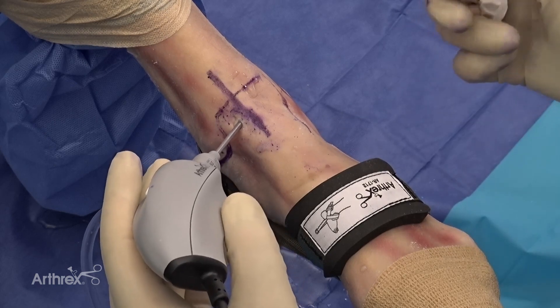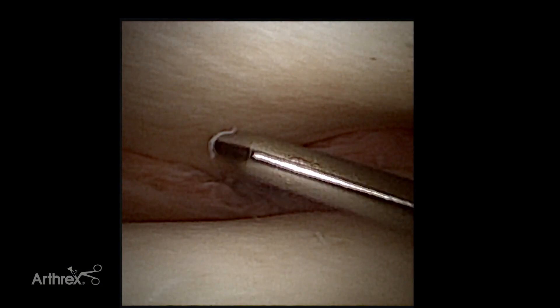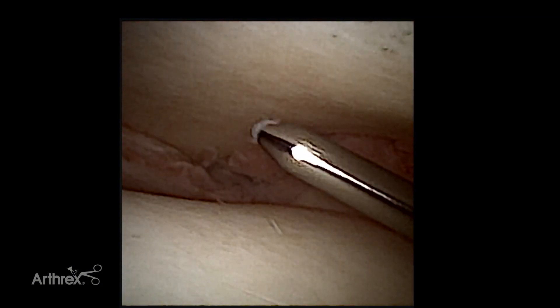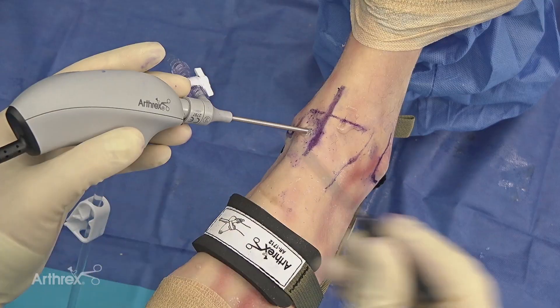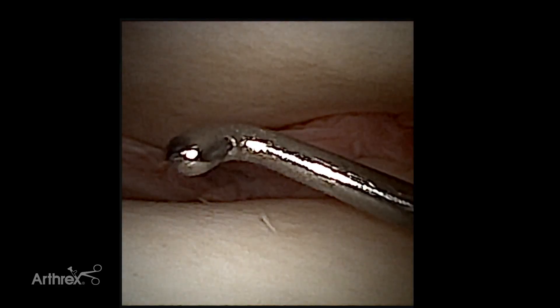I'll take my obturator to create a pathway into the ankle joint, and it's important to use the blunt obturator to avoid injury to the articular cartilage. Once we have our portal established, we can start by inserting our probe to identify any pathology. Here we have our nano reusable probe, which has a two millimeter tip and allows you to palpate both soft tissue and cartilage and evaluate any chondral pathology.